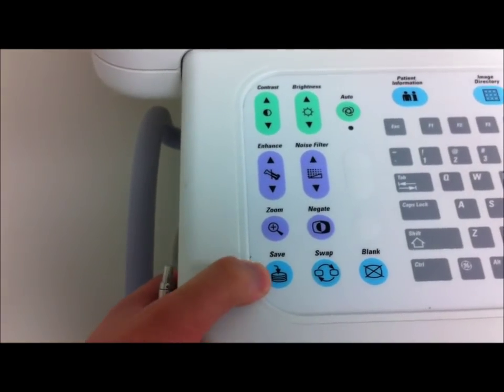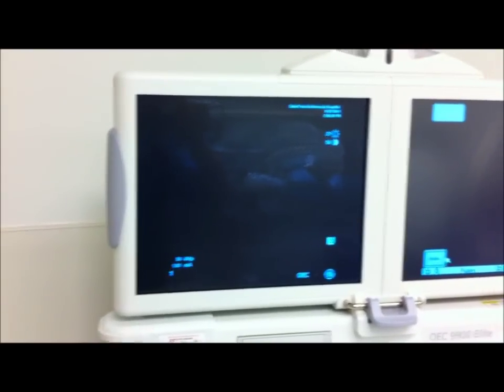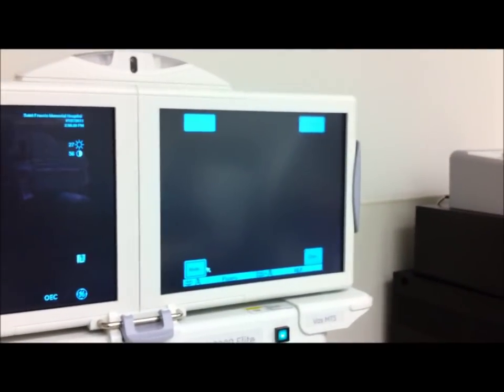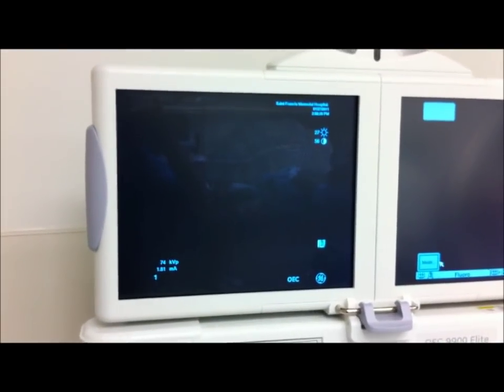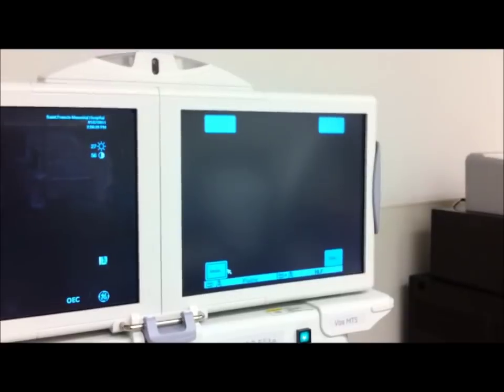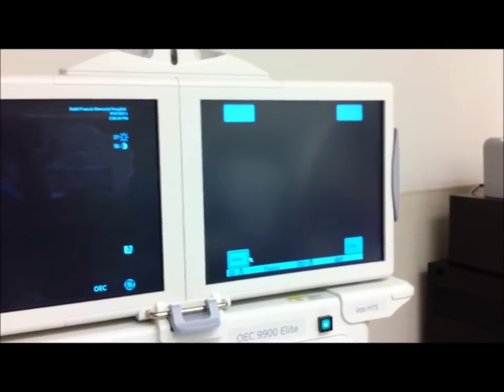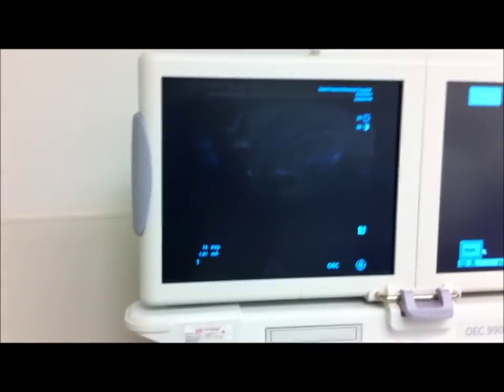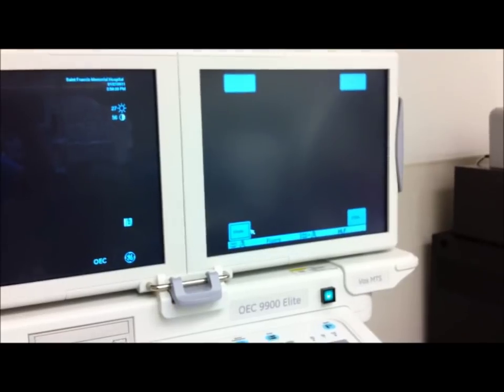This here saves all the images that are on the left screen. This is to swap, so you can flip the image from the left screen to the right screen or from the right screen to the left. Basically, the reason why we do this is because sometimes doctors want to hold the last image we shot on the left side while we fluoro with the right. This way we have a comparison or some sort of base picture to compare to.